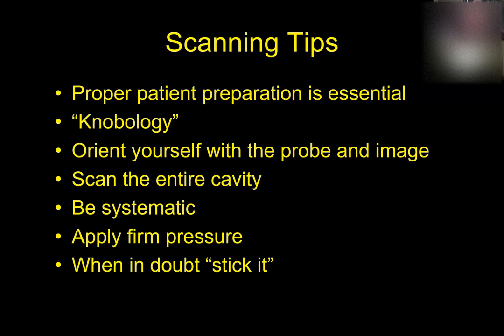There's probably only one or two things that I would say are a good rule to never stick when you're doing ultrasound. One of them is the adrenal glands. Number one, they're pretty small and they're a hard stick, and they have some big blood vessels around them, so you don't want to miss. And two, once you start messing with the adrenal glands, they can excrete a bunch of weird hormones that can have bad effects really quickly once you stick them. So most people would say stay away from adrenal glands with a needle. But everything else in the abdomen is pretty much fair game as long as you can safely do it.